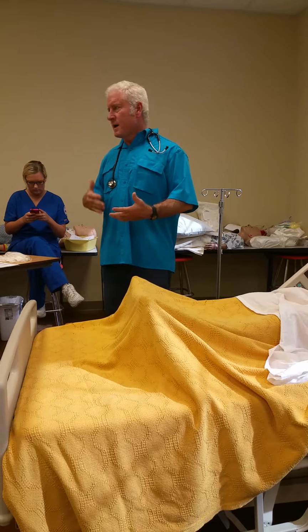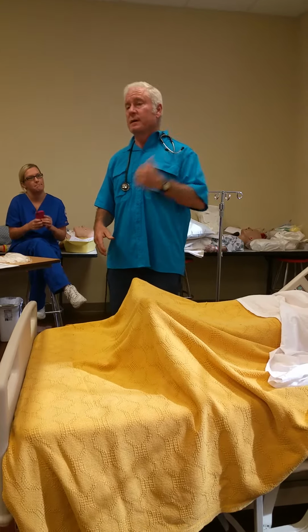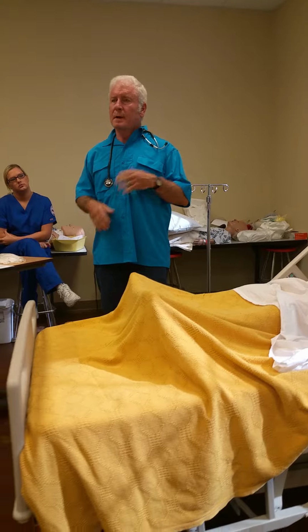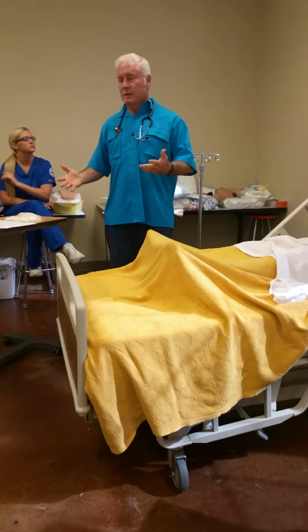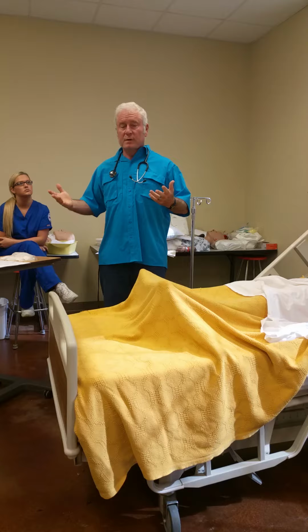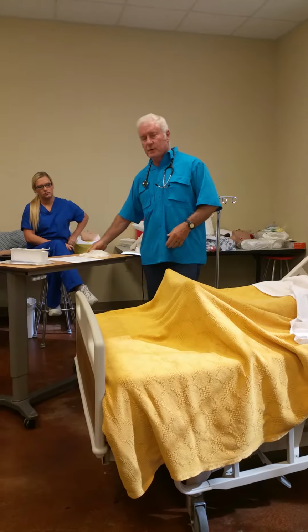If they're in excruciating discomfort, I may put the NG tube in before I do the head to toe assessment. If they're not in a huge amount of discomfort, I may go the other way, just because maybe this is the first time I've actually laid eyes on them, or I just want to check them out really good before I do the NG tube. So it's just based on what's going on with the patient. In this case here, I'm going to do the head to toe assessment first.